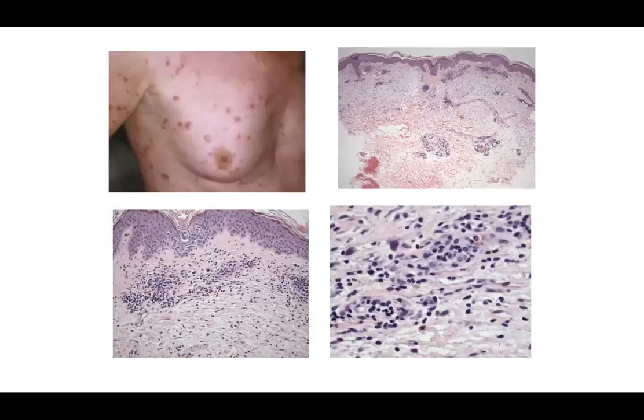Here you can see examples of papular dermatitis. So again, itchy red bump disease, but you have scattered erythematous papules with some overlying excoriated changes here. On histopathology from low power, you see this superficial perivascular lymphocytic infiltrate. You don't see a lot going on in the epidermis. When you go on higher power, you'll see some mild spongiosis. In the higher power, you'll appreciate some perivascular lymphocytic inflammation and some scattered eosinophils as well.